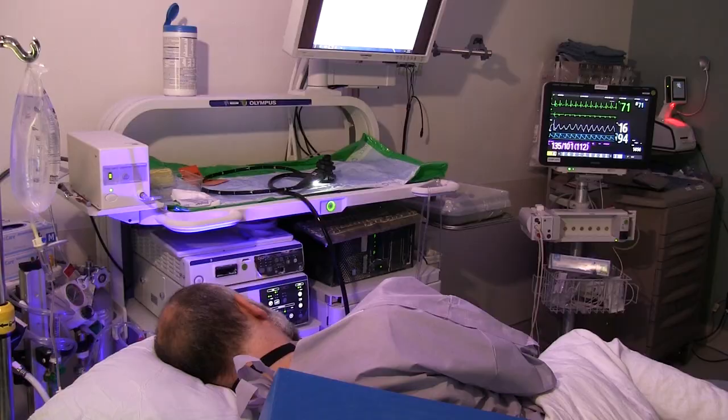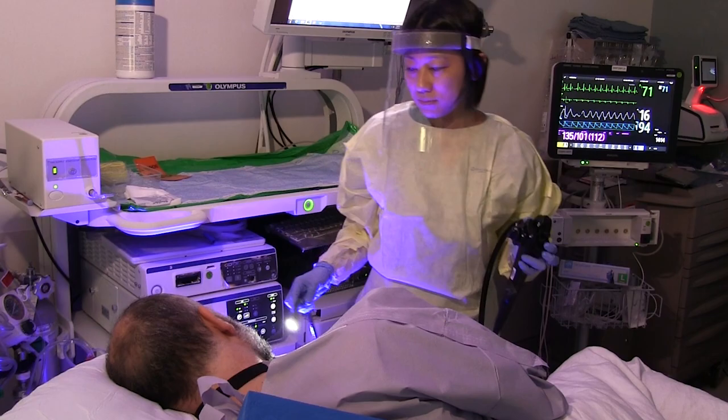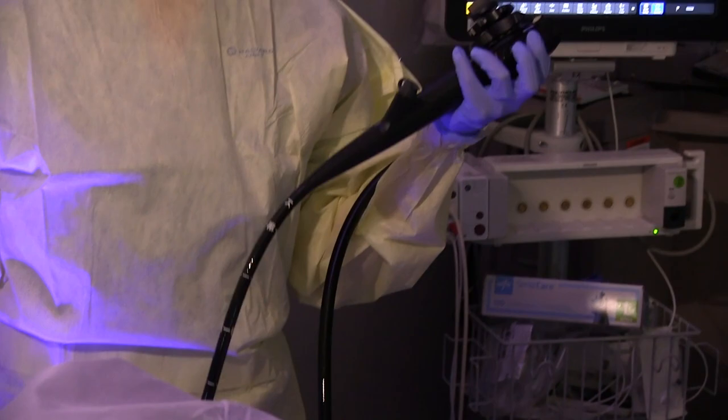Under sedation, we do a standard endoscopic exam to look at your esophagus, stomach, and first part of the small intestine. Afterwards, through the endoscope, we attach a pH capsule about the size of a gel cap to the wall of the lower esophagus.